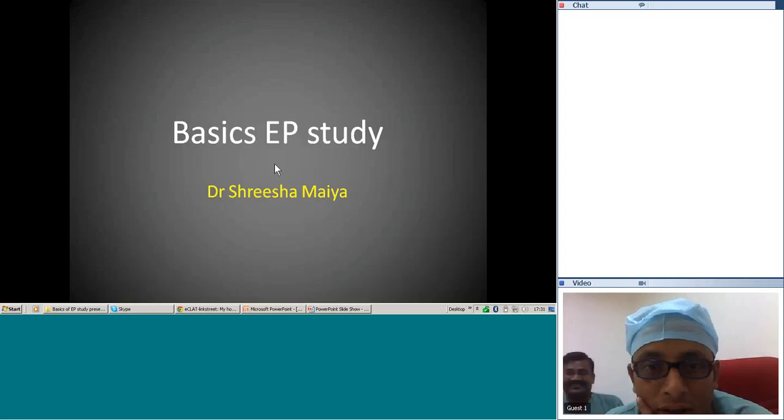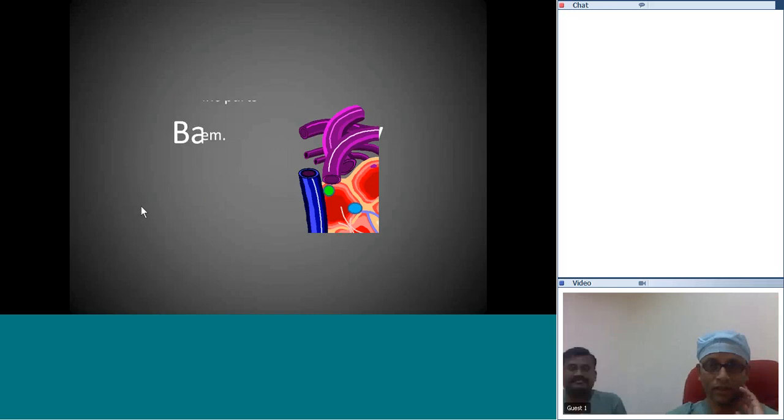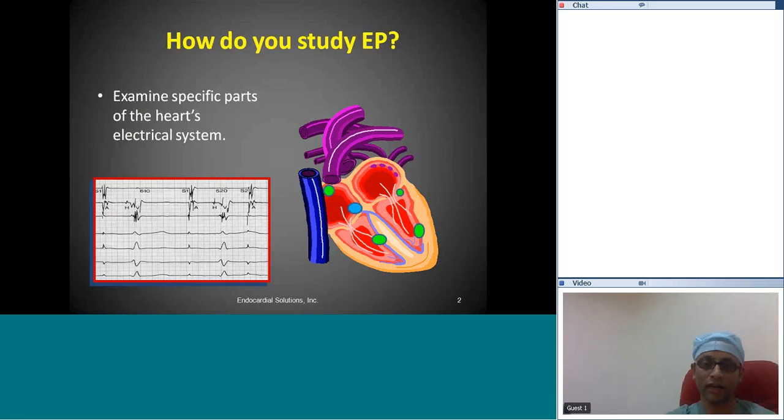Okay, guys, I'm going to talk a little bit on basics of EP study. Now, why do you do an EP study? It is to examine specific parts of the heart's electrical system. So that is the idea behind the EP study. And you then get the intracardiac electrograms because you place catheters at different positions.